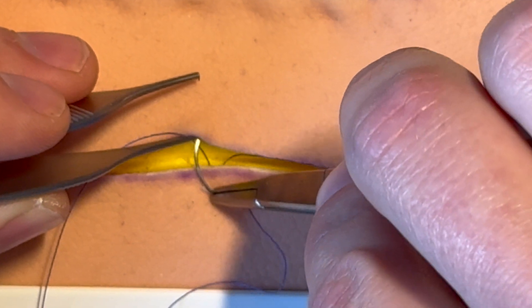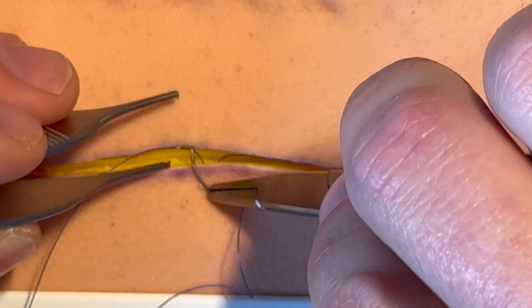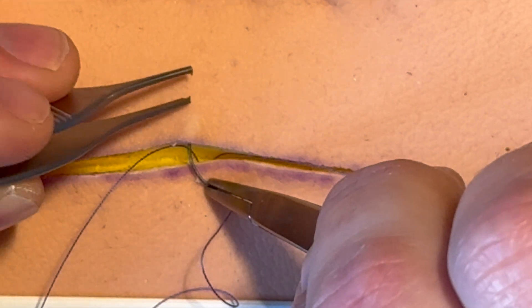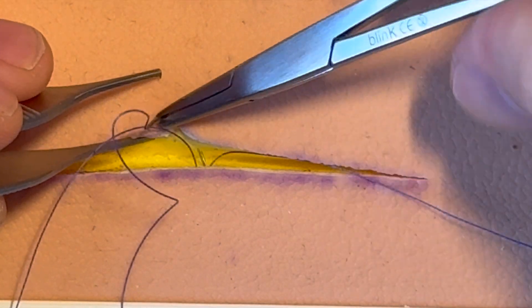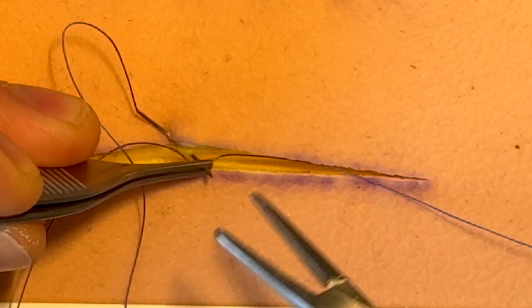Come out in the fat, lift it a little bit, go just into the subcutaneous fat, and go in horizontally — sort of parallel to the skin surface. Then tip it up a little bit until you see a little mound but no steel. Grip that dermis and then turn it back on itself out into the deeper fat where you first went in.